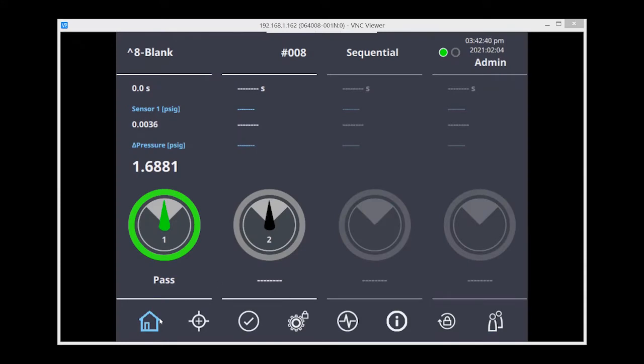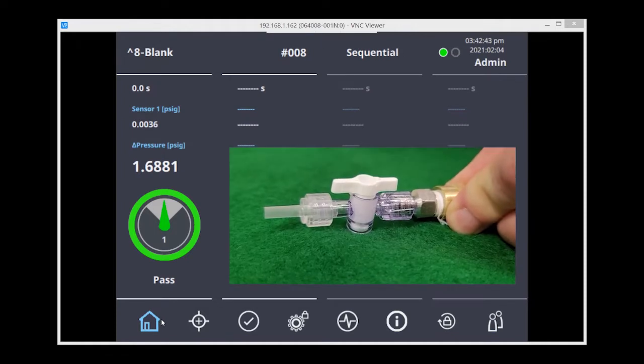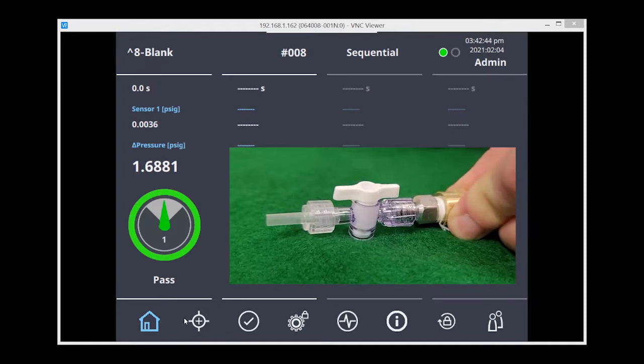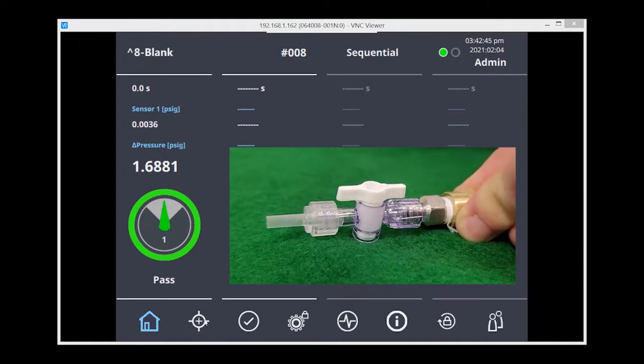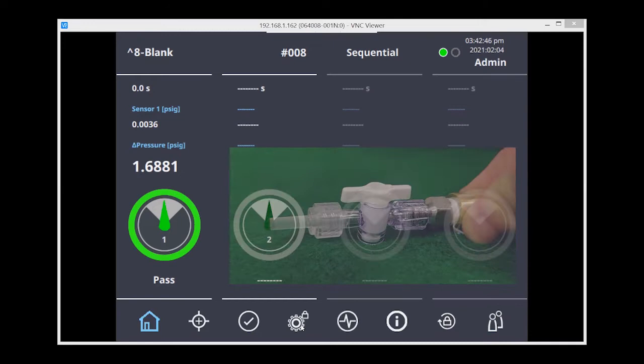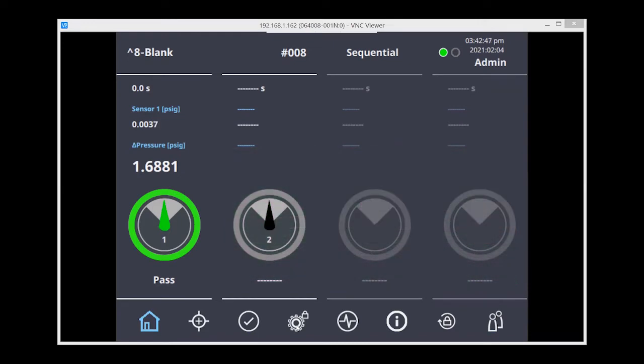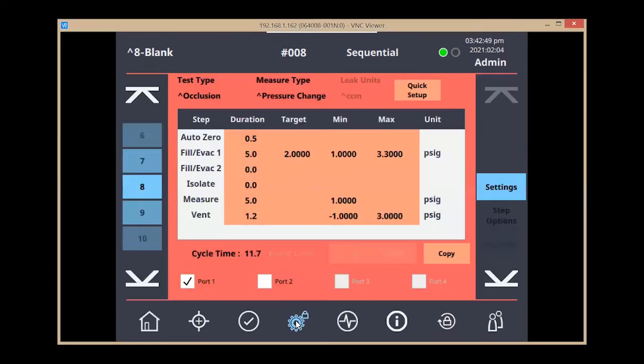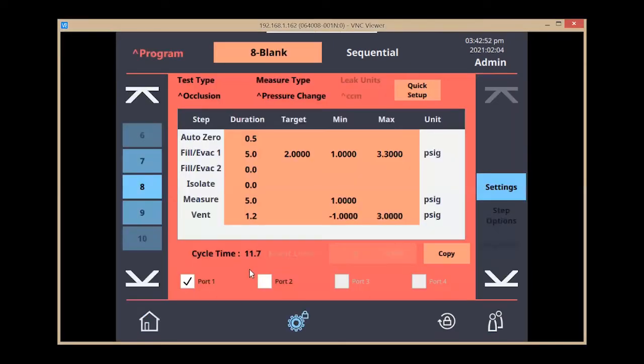So I'm connected to the MD. I have my valve which is currently in the open position representing a non-occluded part. Across the function bar I'm going to select the program menu which is going to bring up the program screen where you can see I have it set for occlusion.